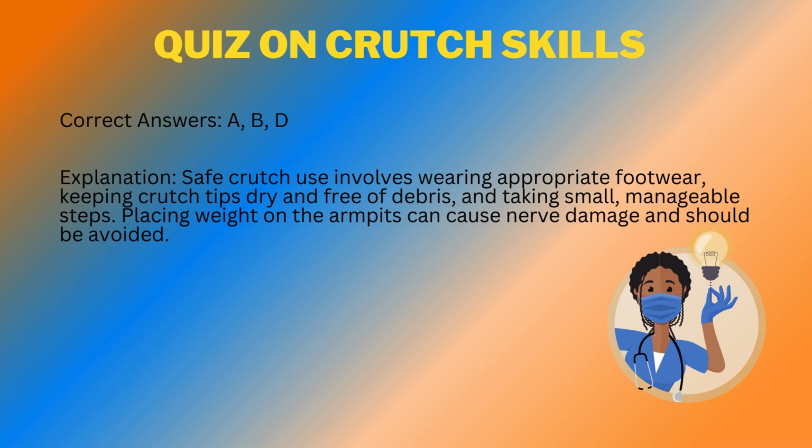Explanation: safe crutch use involves wearing appropriate footwear, keeping crutch tips dry and free of debris, and taking small, manageable steps. Placing weight on the armpits can cause nerve damage and should be avoided.